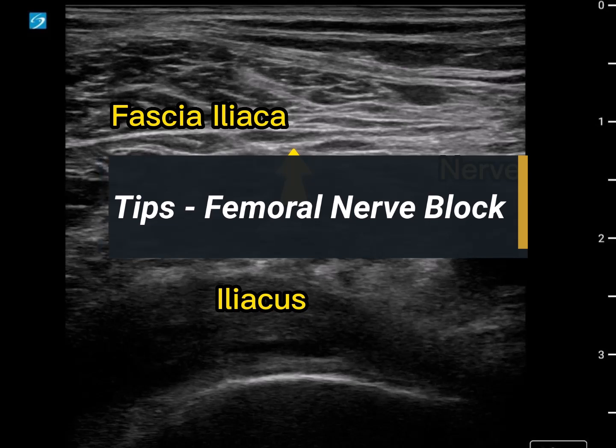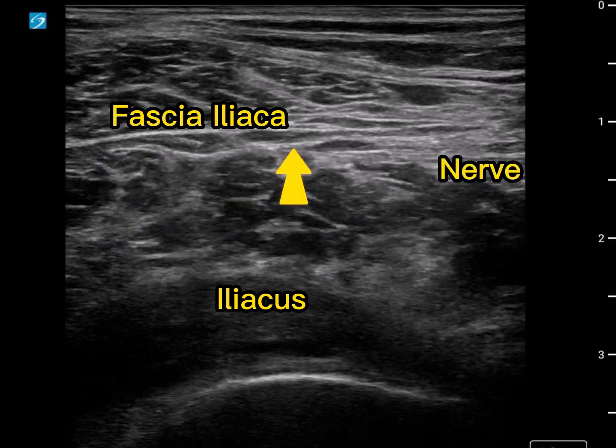This is a femoral nerve block performed on a 90-something-year-old patient who had a mid-shaft fracture and was presenting for an open reduction internal fixation. In our previous scanning we've identified a couple of key structures. We've got our femoral nerve out immediately, we've got our iliacus muscle and what we think is the fascia and the fascia iliaca here, and that's easy to see with some dynamic scanning.